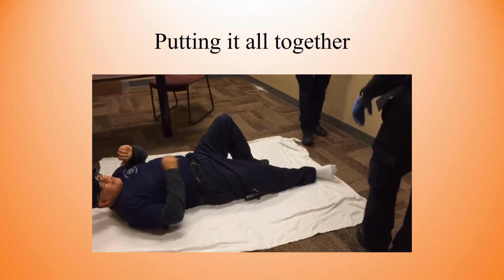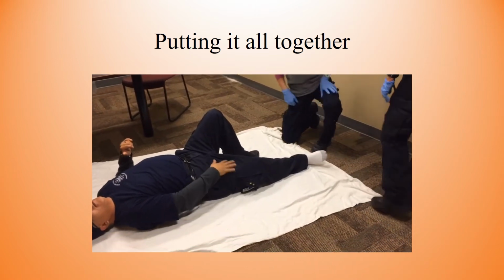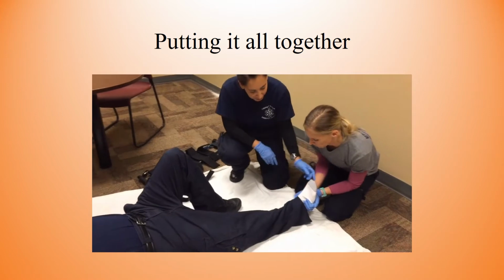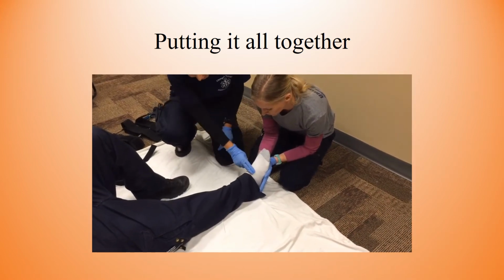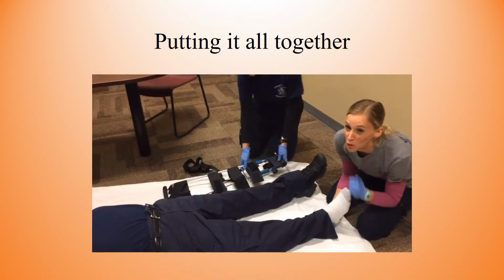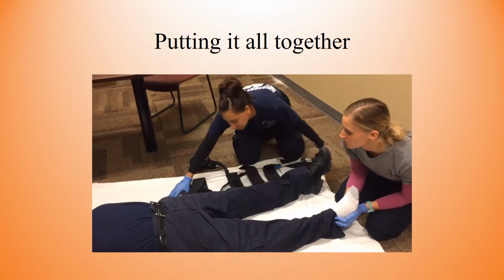I was putting decorations up and I fell over a ladder. Severe pain right here. Thigh area. Hurts like hell. All right, sir. Can you wiggle your toes for me? Yeah. Can you feel me touching your toes? Yes. All right. Can you put this leg out for me? Okay. Oh.